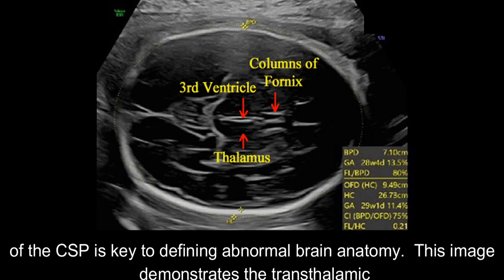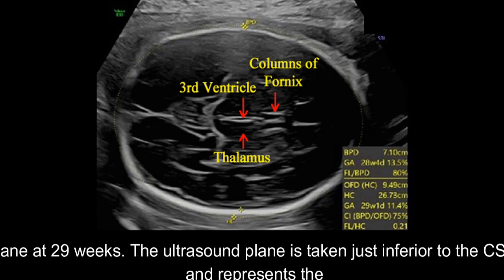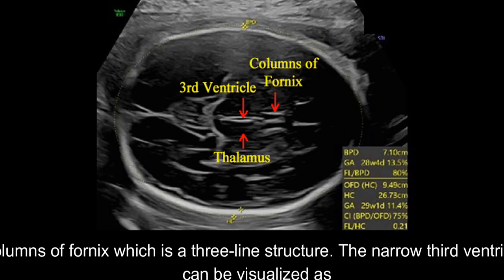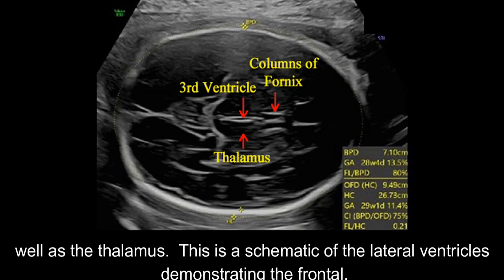This image demonstrates the transthalamic plane at 29 weeks. The ultrasound plane is taken just inferior to the CSP and represents the columns of fornix, which is a three-line structure. The narrow third ventricle can be visualized as well as the thalamus.